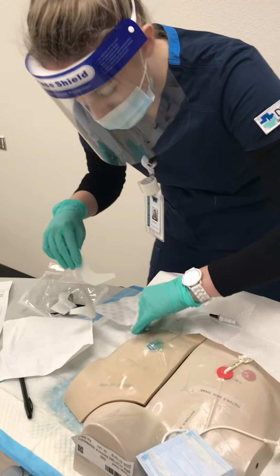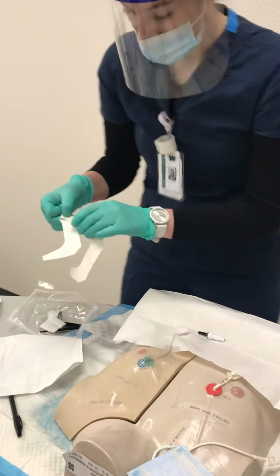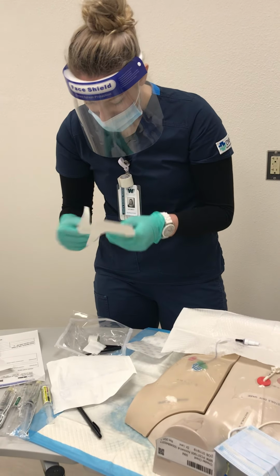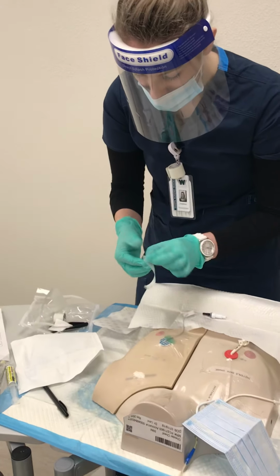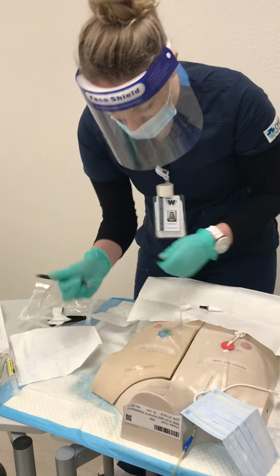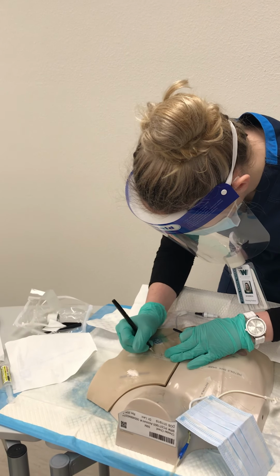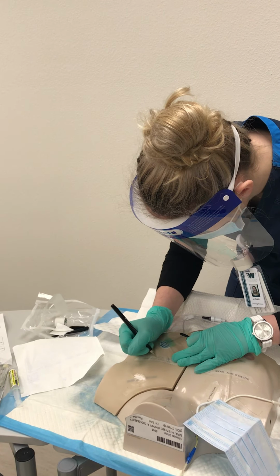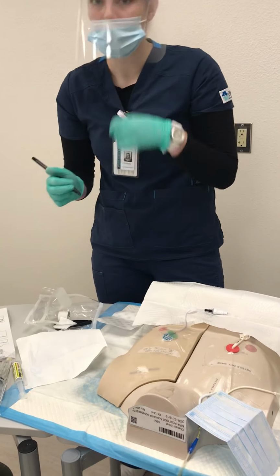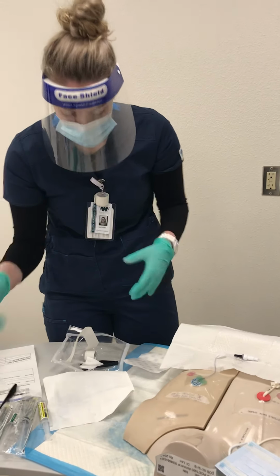So now that this dressing is on, I no longer have to worry about staying sterile. So I have another little piece of tape here that I can add. I'm going to initial it, date it, and time it. So then in 7 days or PRN, the next nurse knows when to change it.